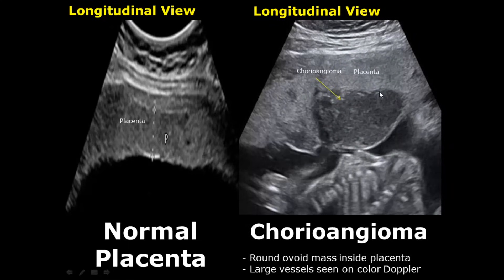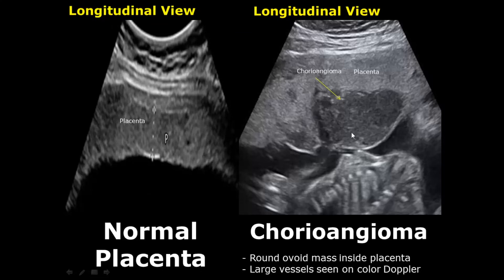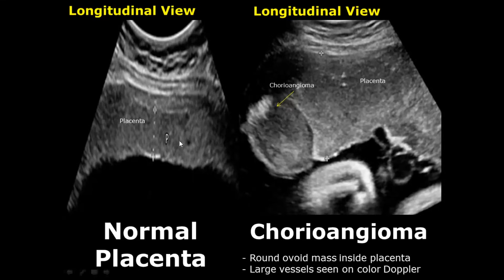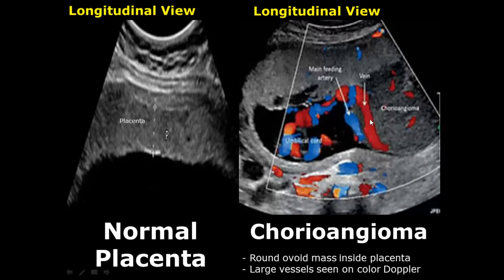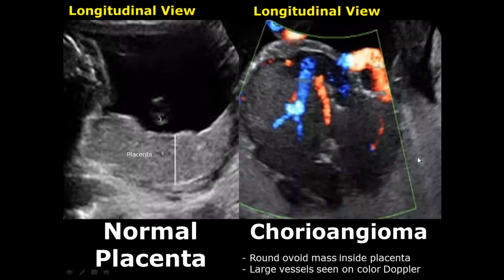One common benign tumor of the placenta is the chorioangioma. It appears as a round or ovoid mass inside the placenta; usually it is hypoechoic compared to the surrounding placental tissue. On color Doppler we will see large blood vessels supplying the mass — both arteries and veins — indicating a very large blood supply. Here is another Doppler image showing large vessels supplying the chorioangioma.